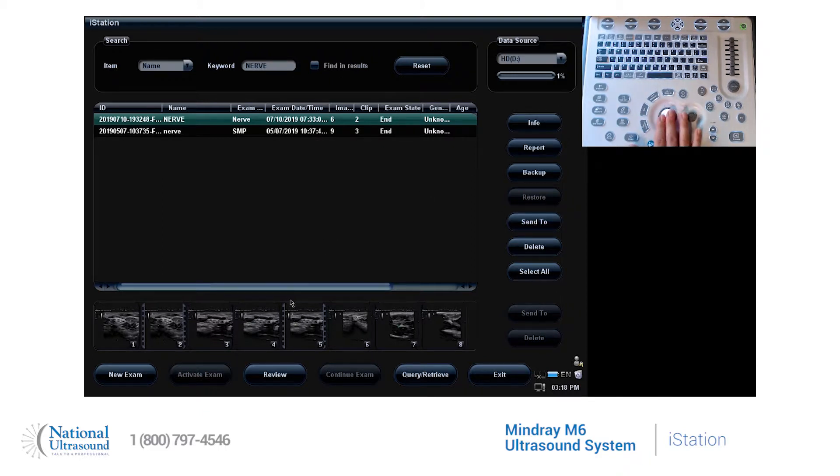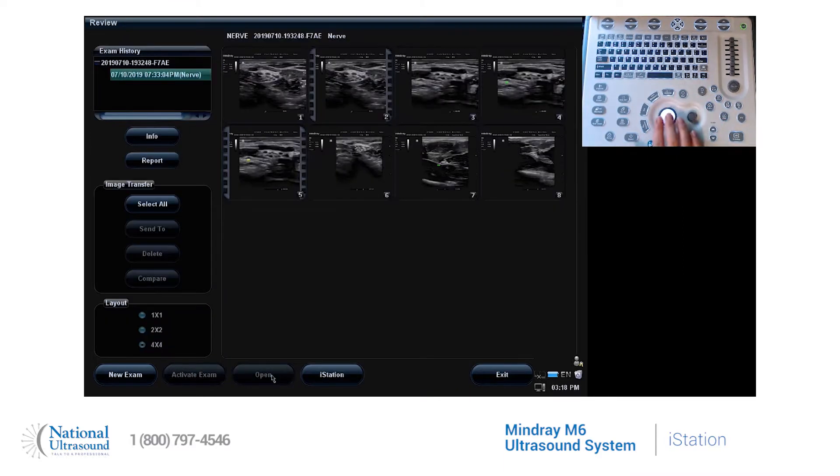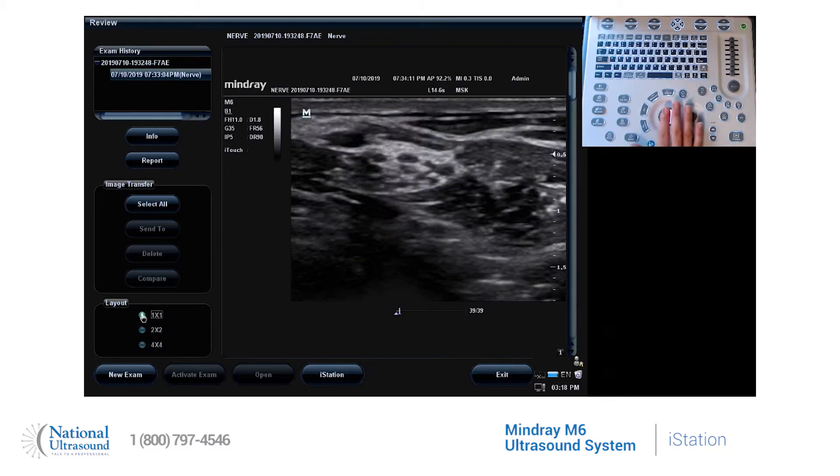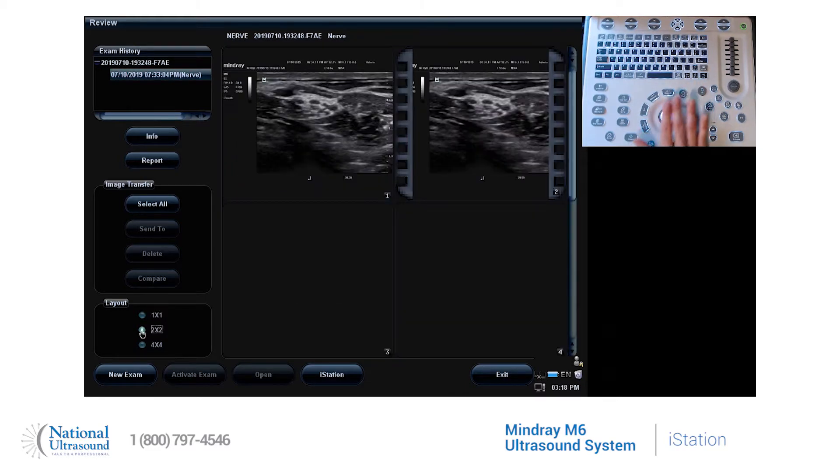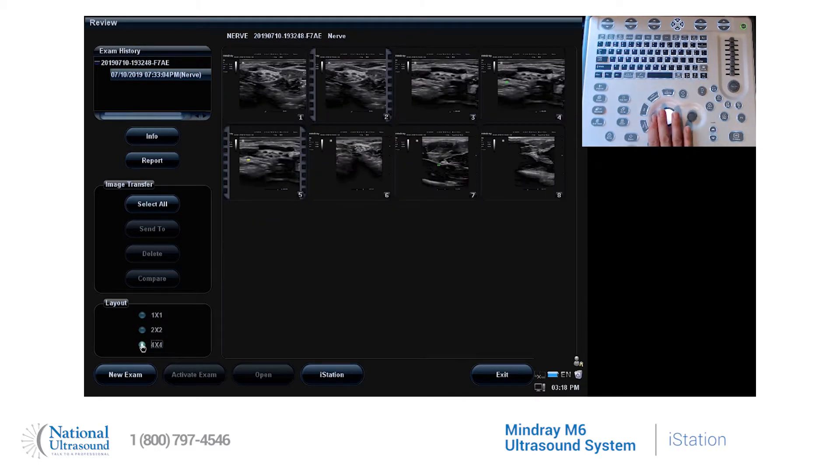To review images, you can click on the review button. There are different formats to choose on the bottom left corner of 1x1, 2x2, and 4x4.